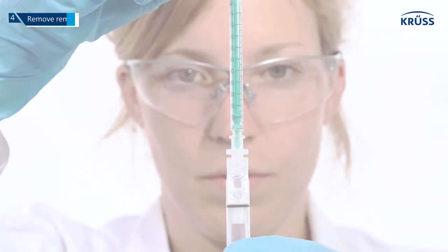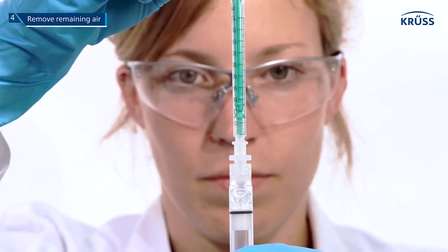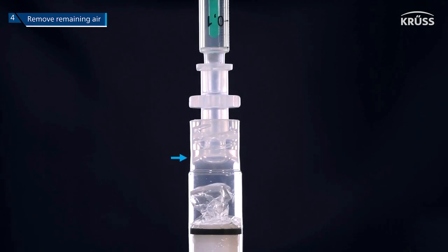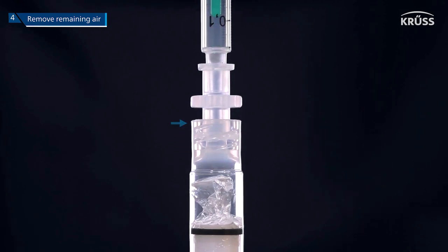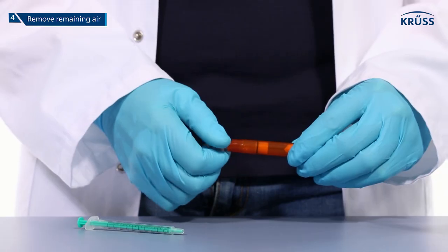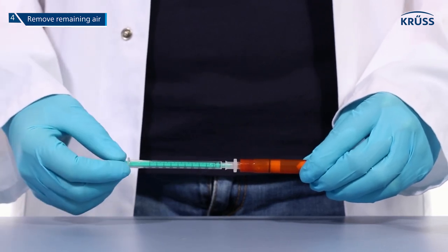Step 4. Pull any remaining air out of the cartridge and at the same time pull the liquid level up until the liquid's meniscus is even with the top of the cartridge. Now you may place the cartridge back into the instrument while holding it upside down. Repeat the process with the second cartridge.